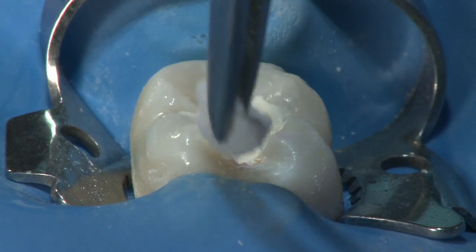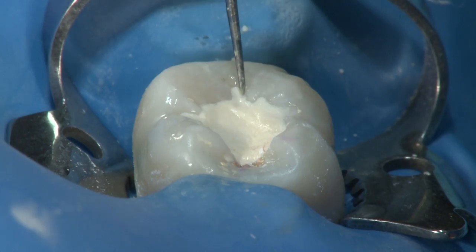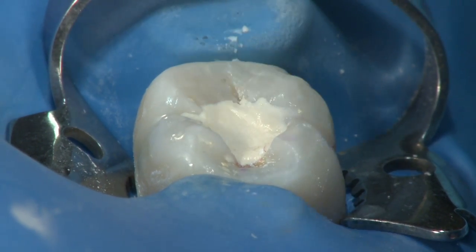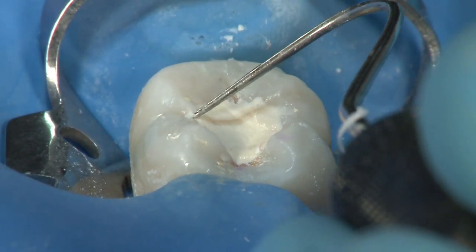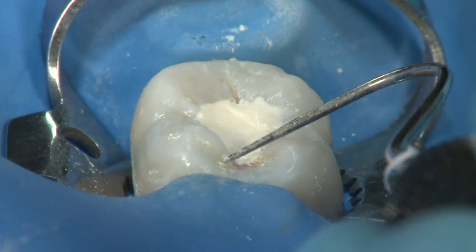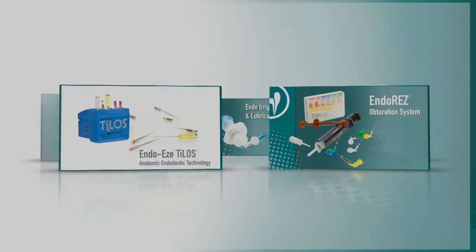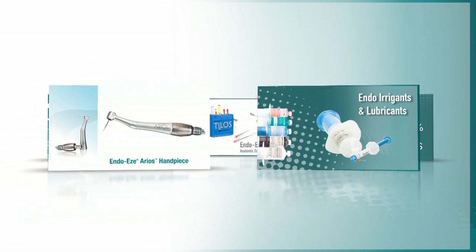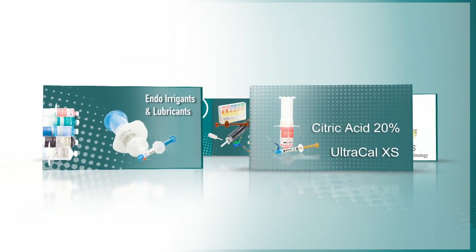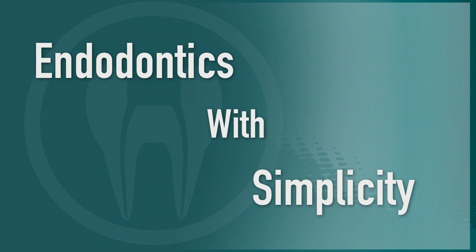Throughout this procedure, we've demonstrated how effective minimally invasive endodontics can be performed in a safe but efficient manner. By using the natural anatomy of the tooth as a guide, dentin is preserved, thus maintaining the strength of the natural tooth. Ultradent Endodontic Products solve everyday endodontic problems, giving you the ability to treat most endodontic cases with simplicity.